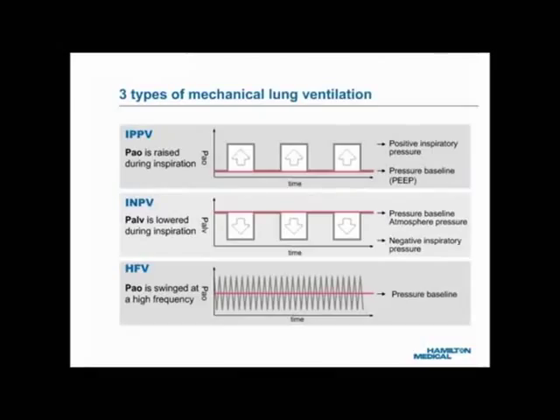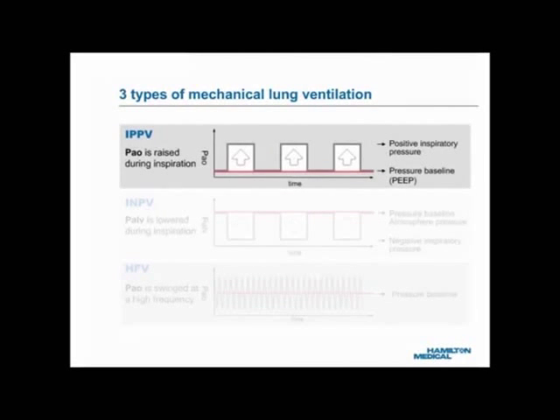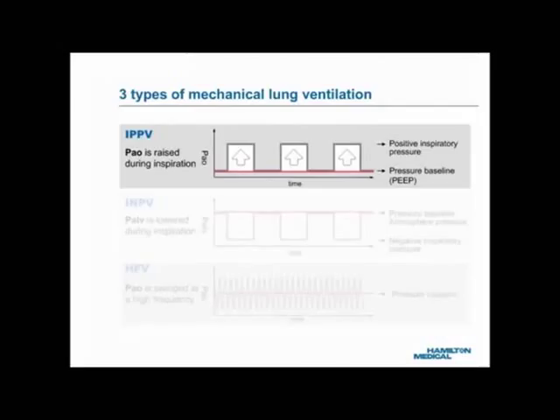Artificial lung ventilation, or mechanical ventilation, can be performed using one of three working principles. One: the top graph shows the pressure waveform of IPPV, or intermittent positive pressure ventilation. Using this principle, a positive airway opening pressure, or PAO, is applied intermittently above the pressure baseline, shown here in red. The positive PAO pushes the inspiratory gas into the lungs. The baseline pressure is called positive end expiratory pressure, or PEEP, and is usually higher than the local atmospheric pressure.